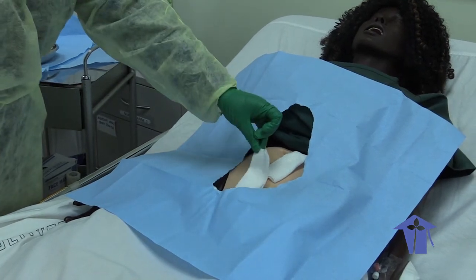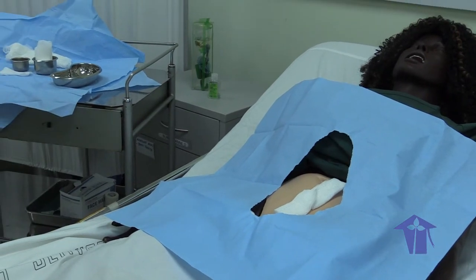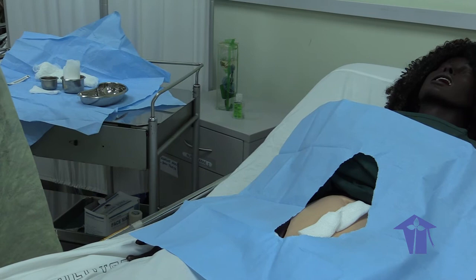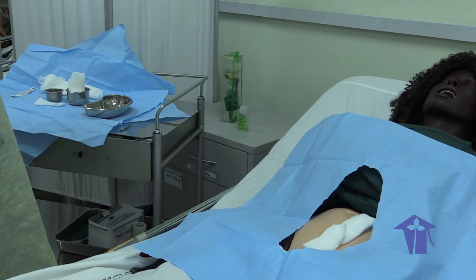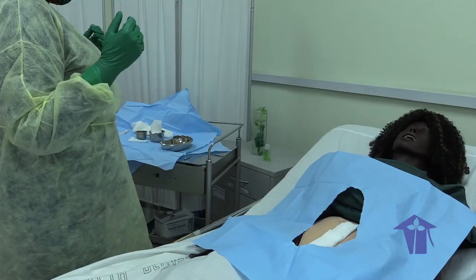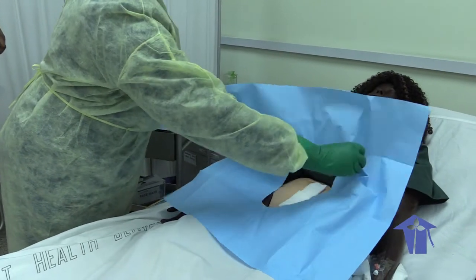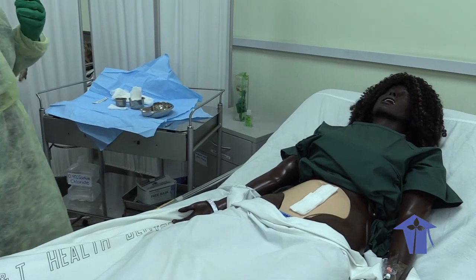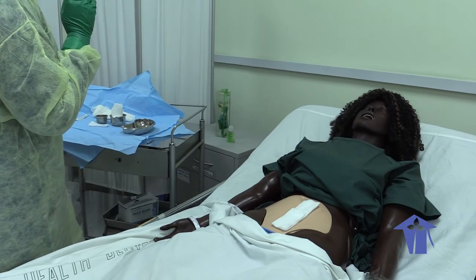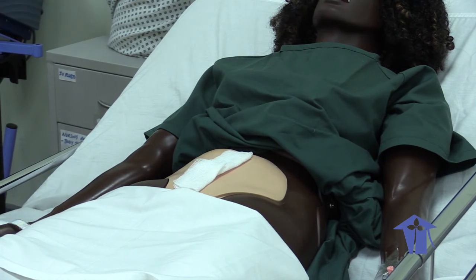Use your sterile hand to dress the wound. Once the wound is covered, you can now use tape or the required covering for the sterile gauze. We can now remove the sterile drape, and cover the sterile gauze with the appropriate adhesive dressing.